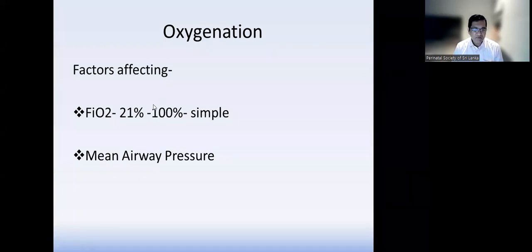So FiO2 is from 21% to 100%. I'm discussing from the very basics because I think there are nurses and doctors, a mixed crowd. I'm touching on the very basic steps.